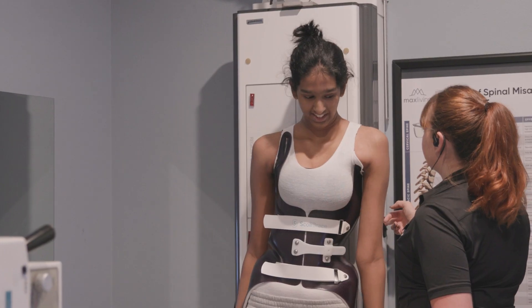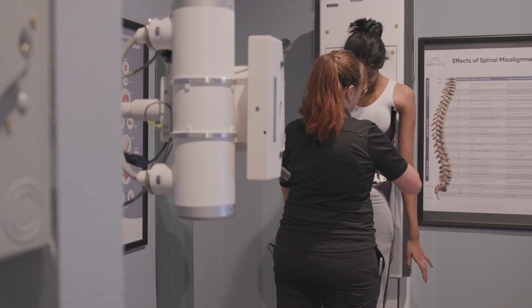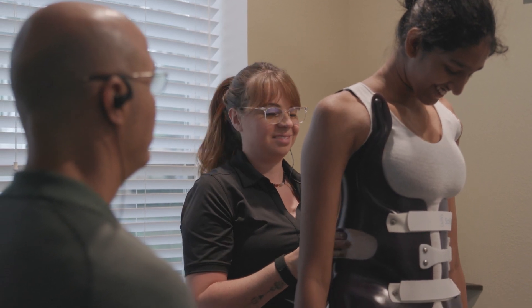With traditional TLSO braces, curves tend to worsen and the torso tends to worsen with them, and when the brace is removed nothing actually changes. There's a false sense of security because x-rays taken in the brace look better due to the squeezing effect. With corrective braces, we see the curve improve both in the brace and when the brace is removed, and the shape of the torso is better too. When we're changing the shape of the torso and reducing the x-ray measurement, these results are very long-lasting because we're making a structural change to the person's body.